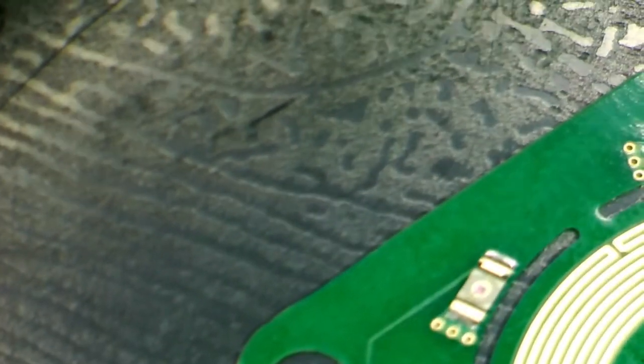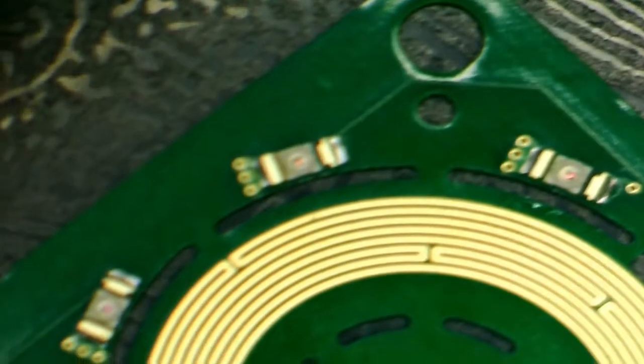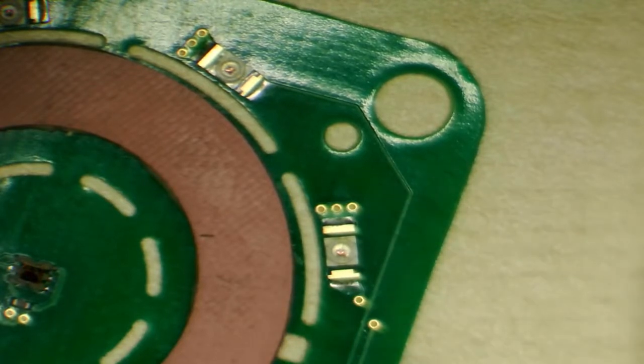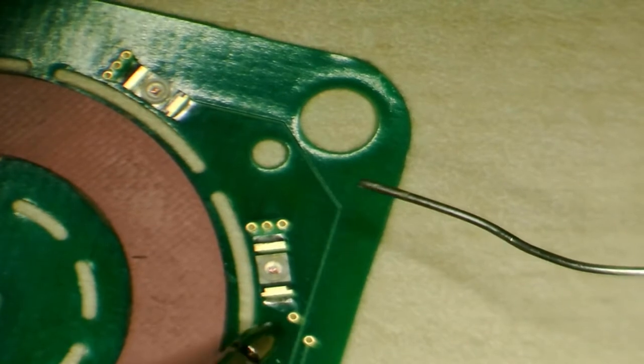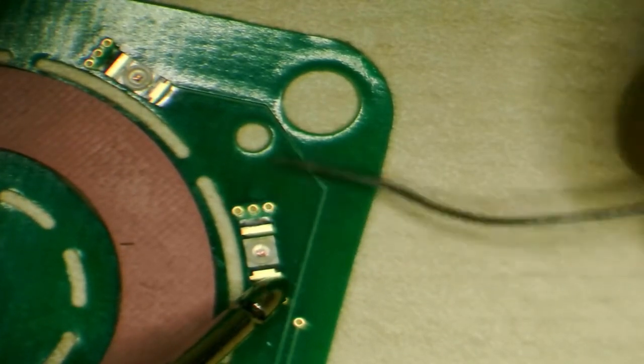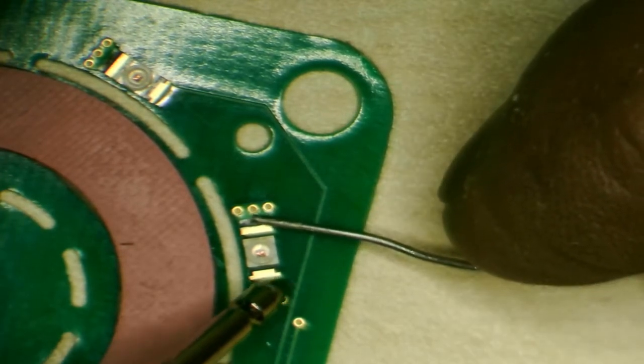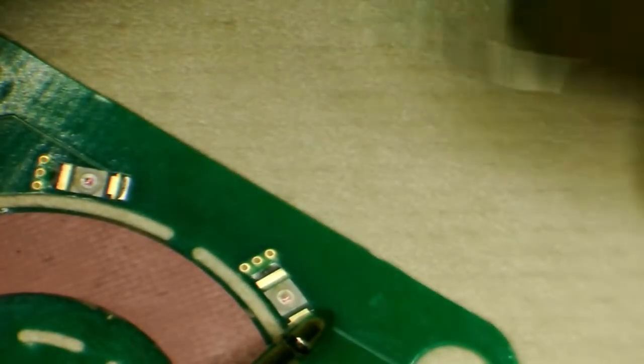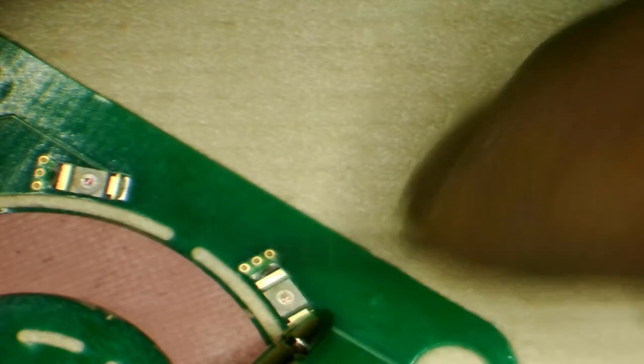What I've decided to do is to see if we can power up those LEDs, and to do it I've used a 5K resistor in series with a 5-volt power source. We'll try this one over here. Whoops, there was a light. Bingo. So it looks like it's a yellow LED. And we'll try these other ones. Yep. And this one. It's yellow too. So it looks like they're probably all yellow.